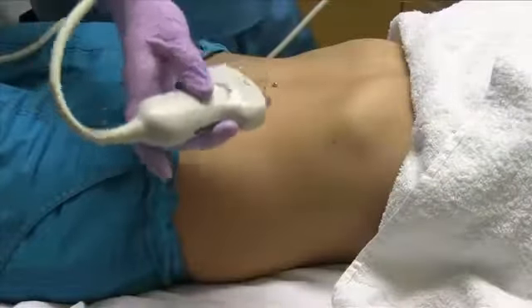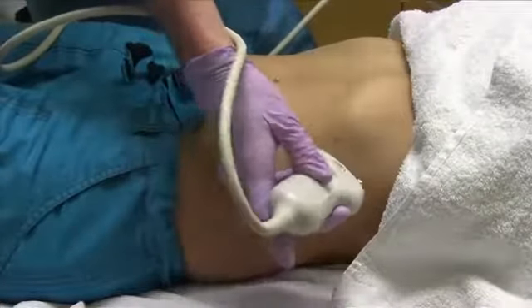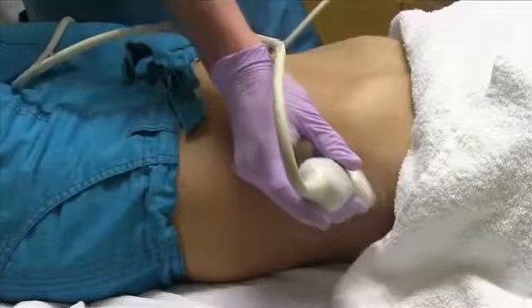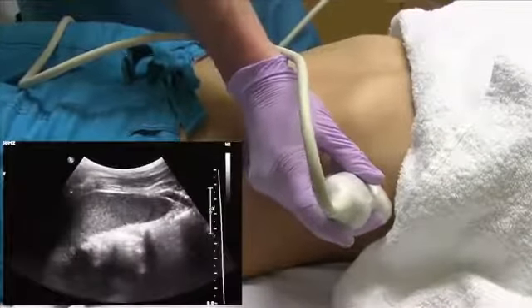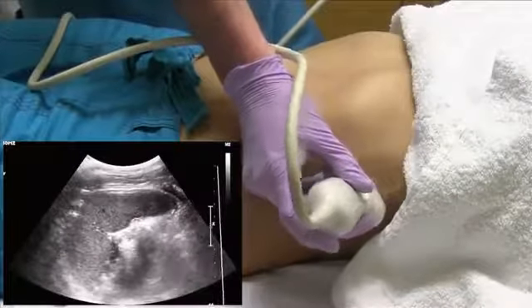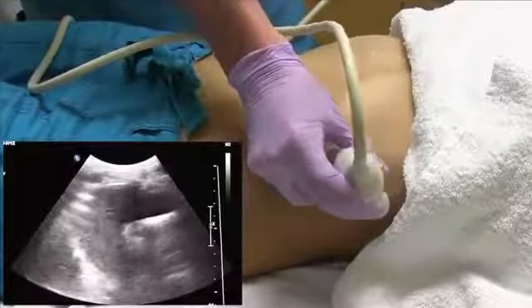So to image the spleen, you're going to come to the patient's left side, and again, you're going to want to make sure you're scanning right in this rib space here. So your probe is going to be slightly obliqued. And once you find that rib space, you'll feel the probe drop down into it. And from here, you just want to make sure you're sweeping through that entire rib space.